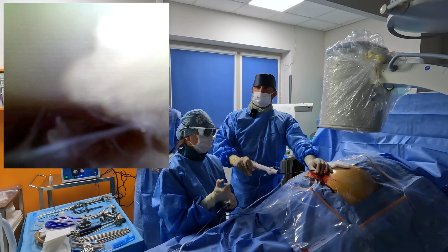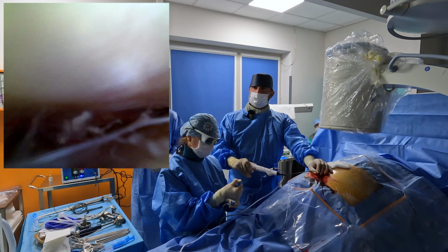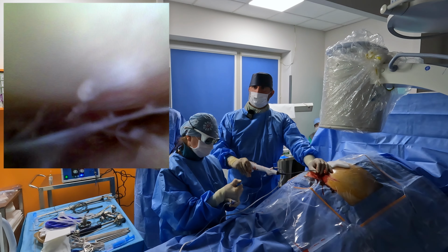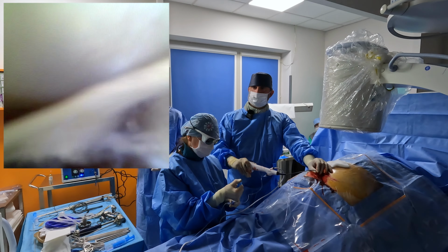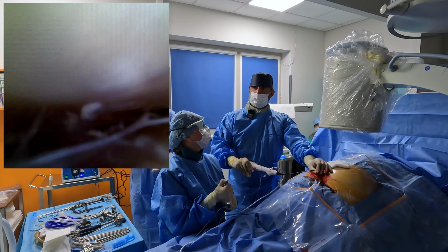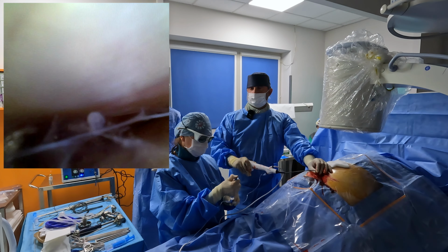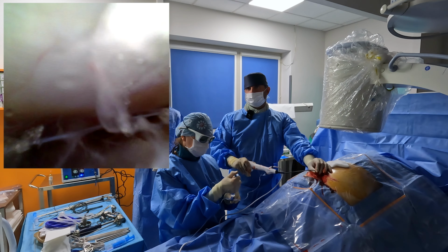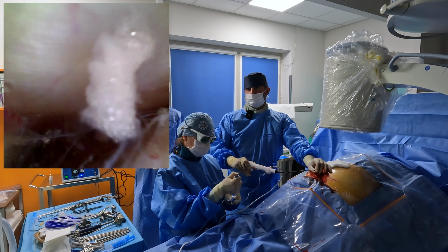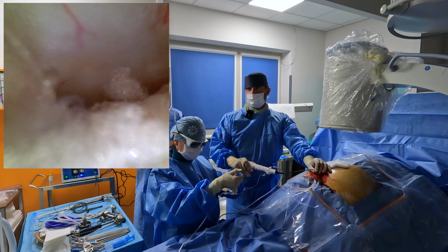You can also use this technique if, for example, you have a disc herniation which is going with a cranial propagation behind the vertebral body from one level down to the other level, and you are not sure that you have taken all the herniation outside. You can take the epiduroscope, and at the end of the surgery you can have a look if everything is extracted.